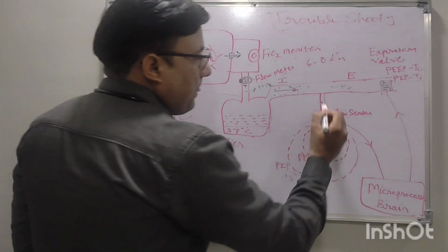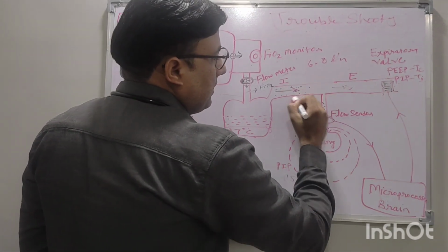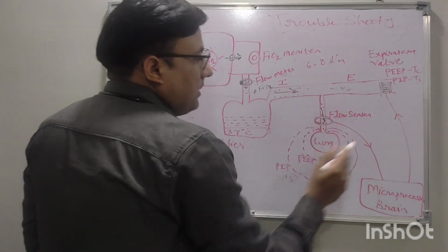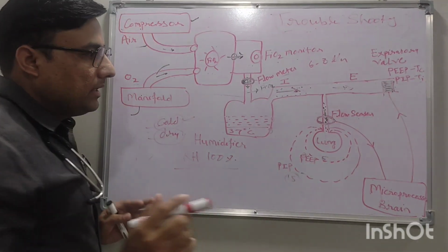Third, if there are any loose connections in the circuit, that also will make the tidal volume delivery less.